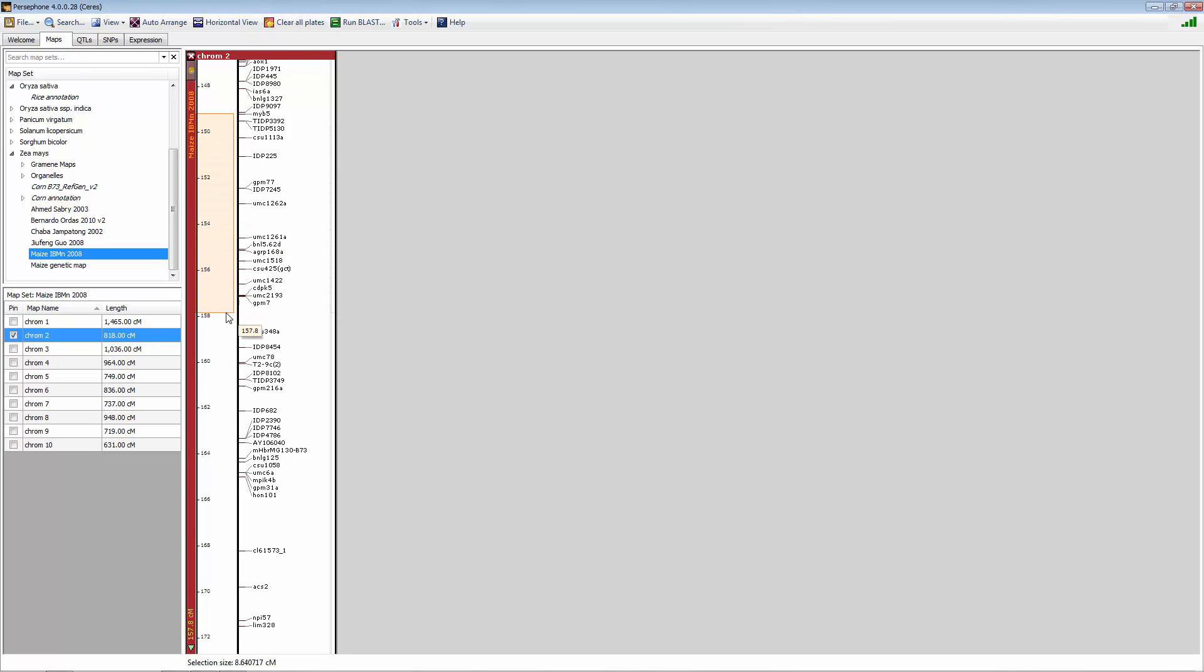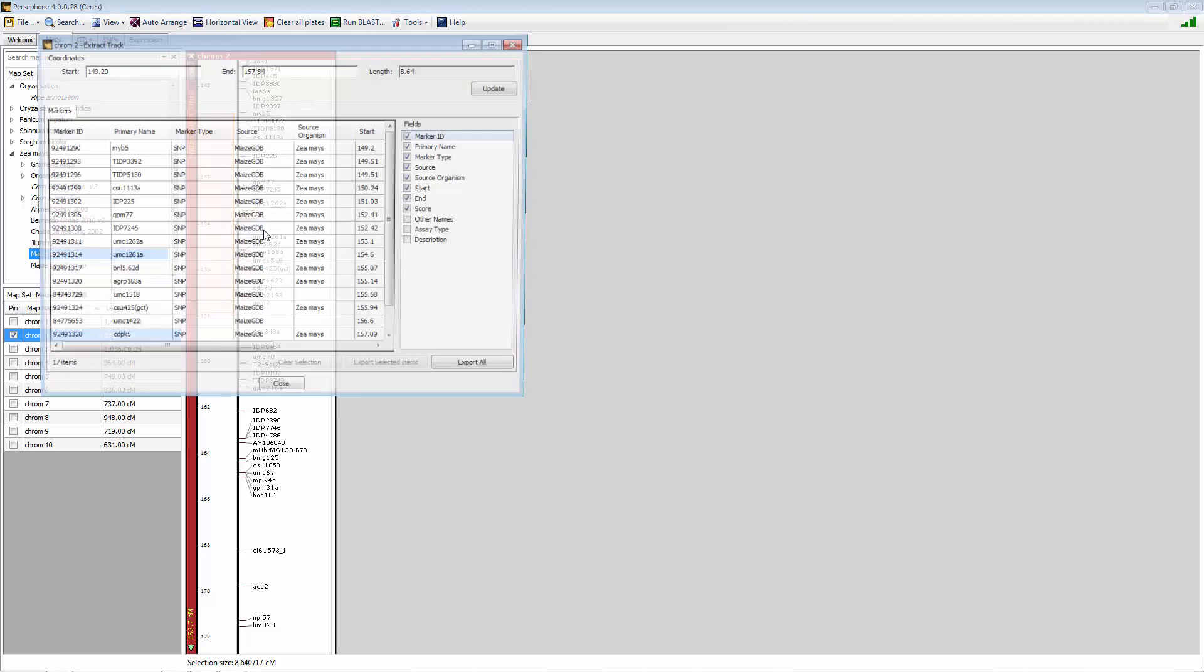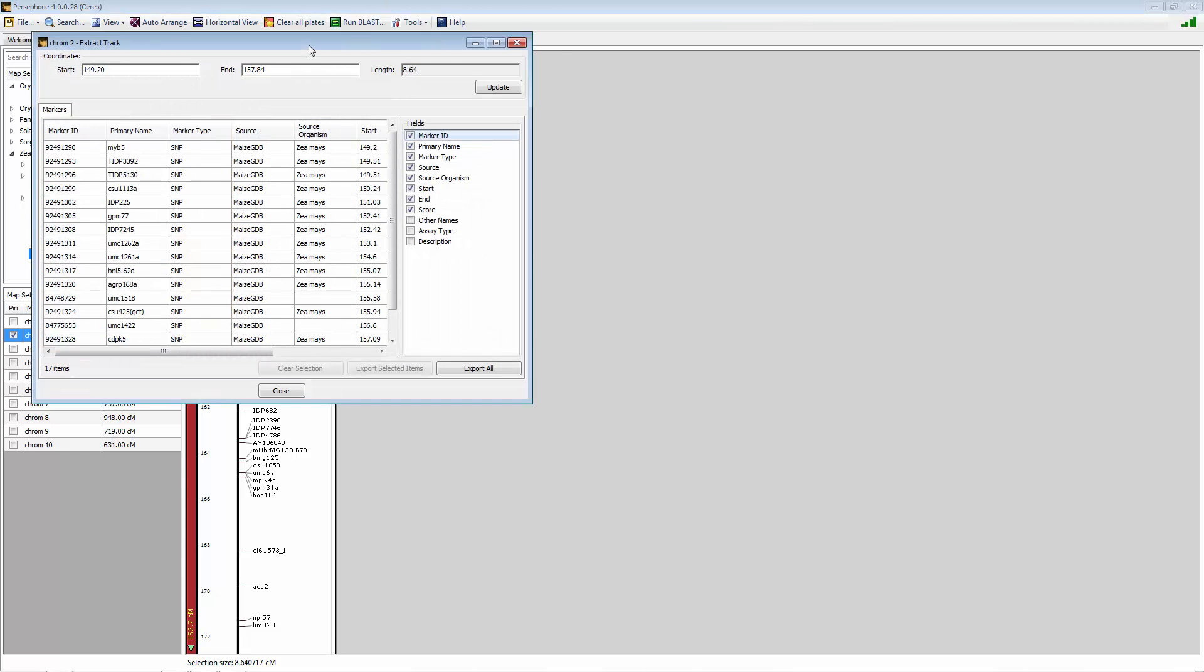We can select a given region similar to how we did last time by hitting the control button and the left mouse button. Once again, when we select a given region, we can right click on it and get this export track functionality.